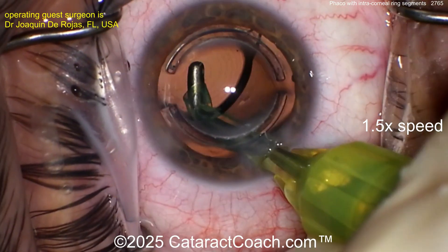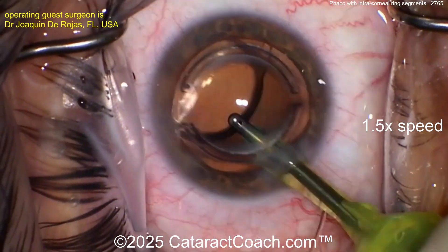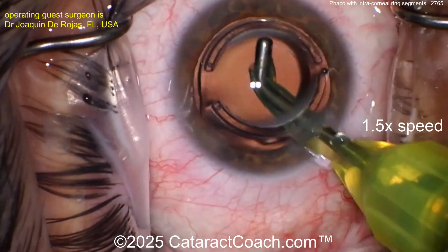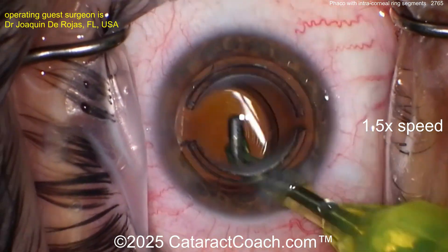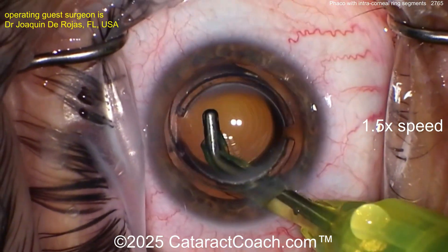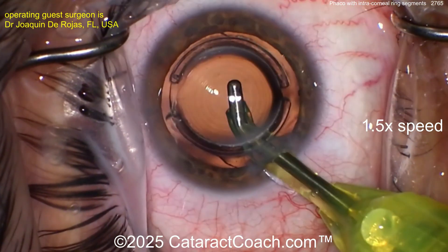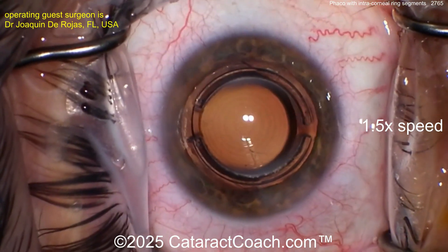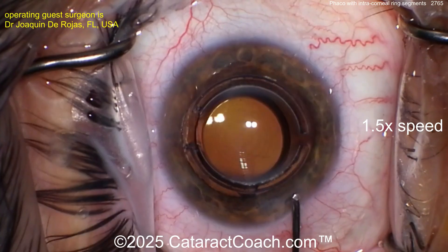The patient in this video is actually an ophthalmologist — in fact, a high-volume cataract surgeon — so this patient knows what he or she wants. They elected to keep the ring segments in. At the end of the case you can see a beautifully positioned trifocal lens with the diffractive rings getting nicely centered. And yes, it's not a femto rhexis — it's a manually made rhexis, which is what this cataract surgeon desired.